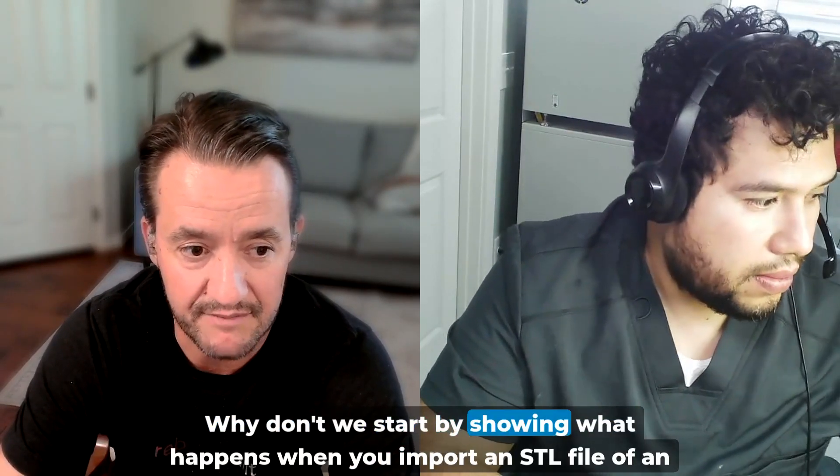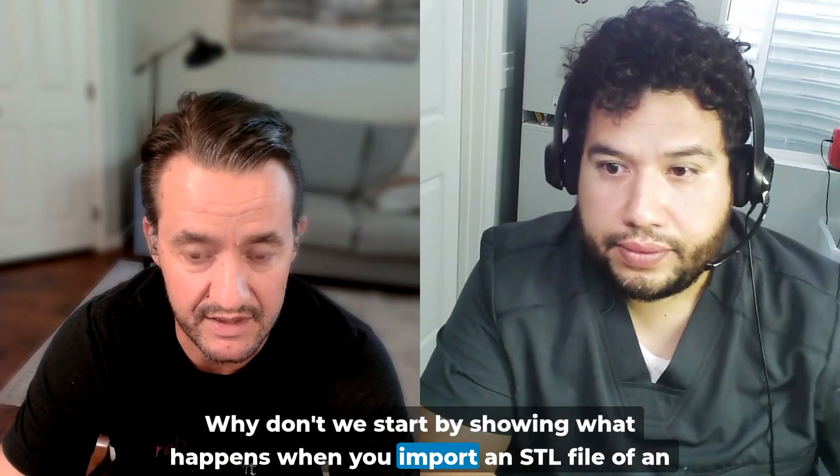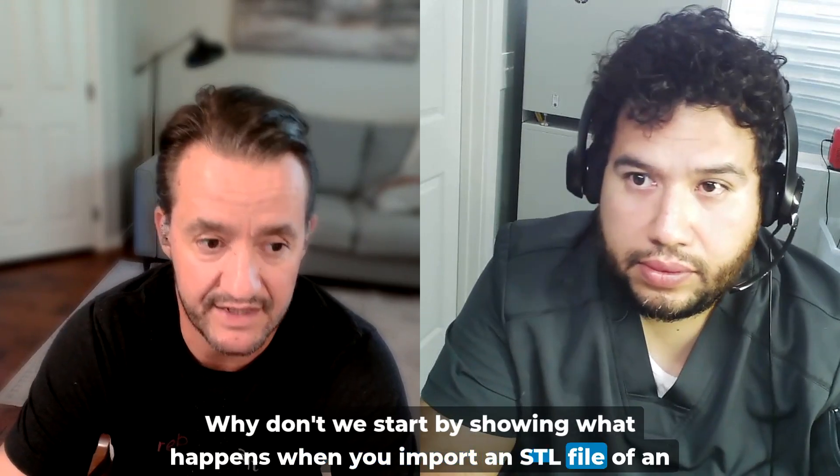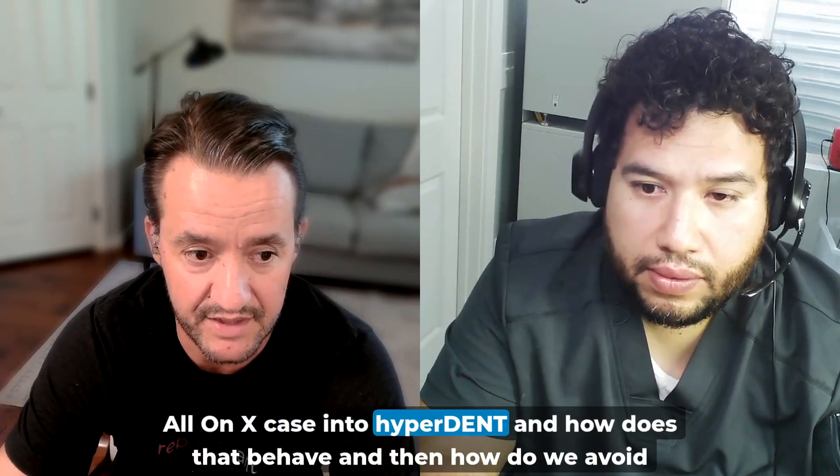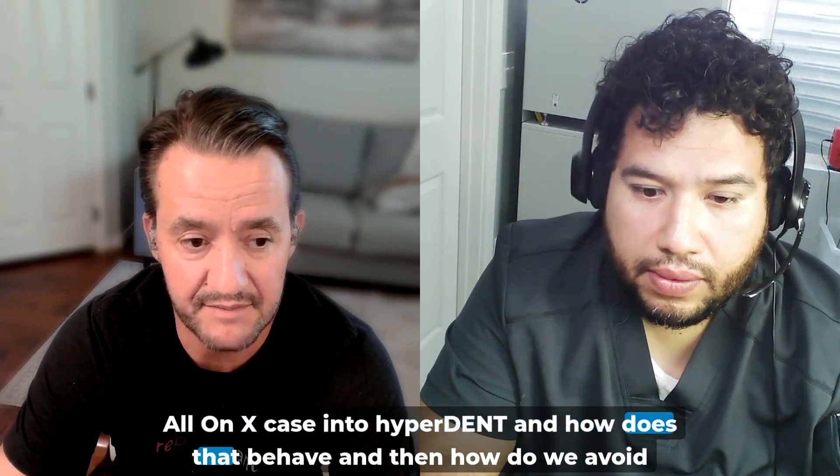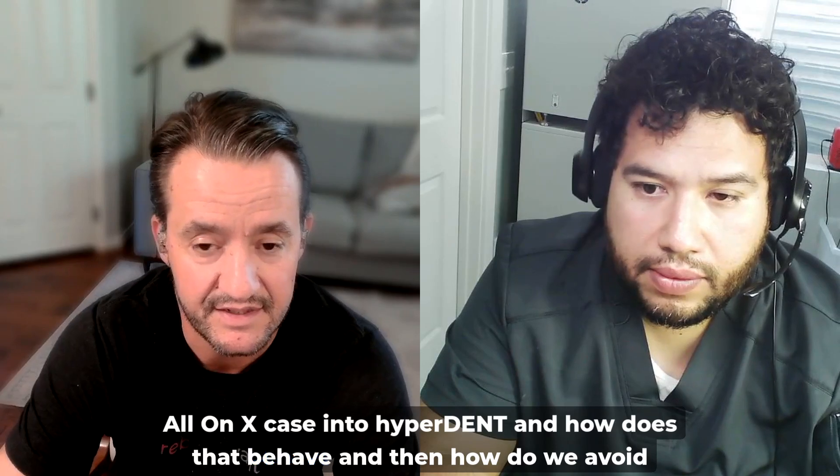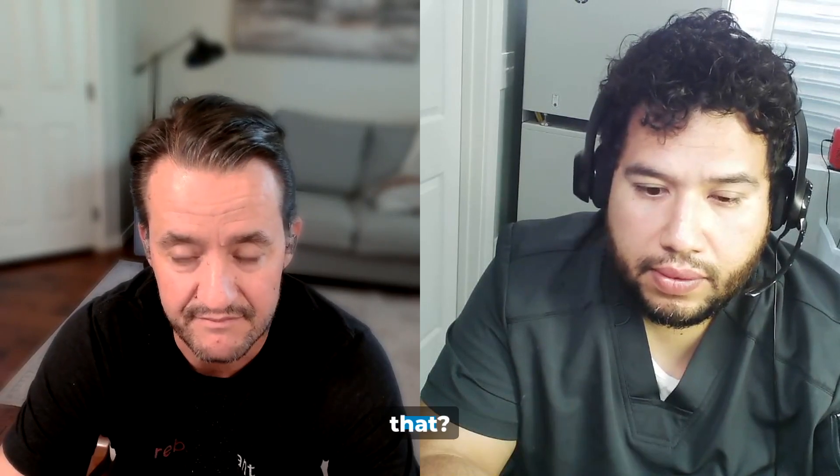Why don't we start by showing what happens when you import an STL file of an All-On-X case into HyperDent, and how does that behave, and then how do we avoid that?